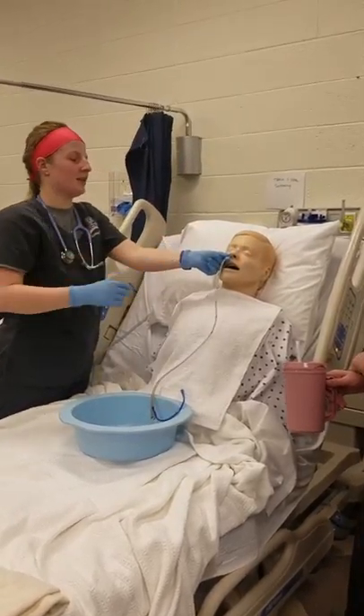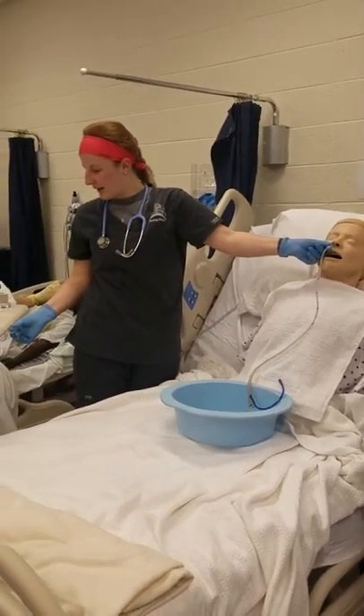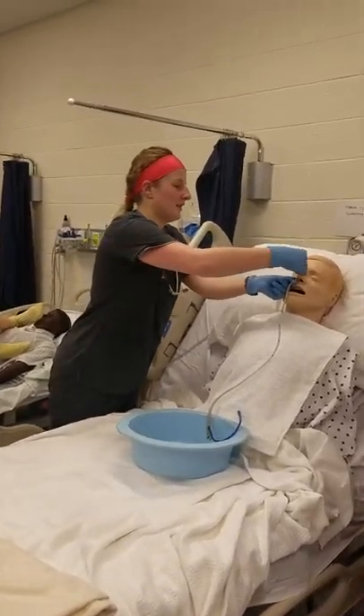Since I'm at my marker and I'm at resistance, I'm going to go ahead and take it down and secure it.